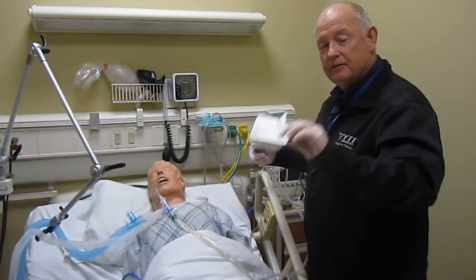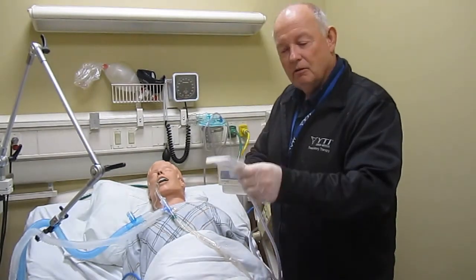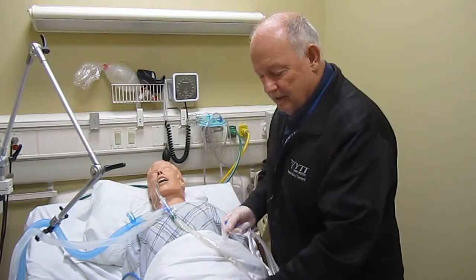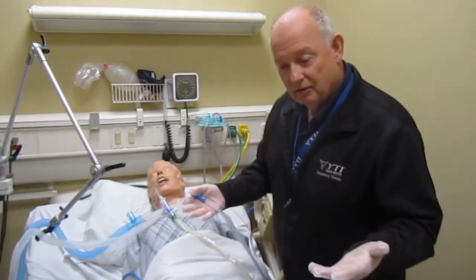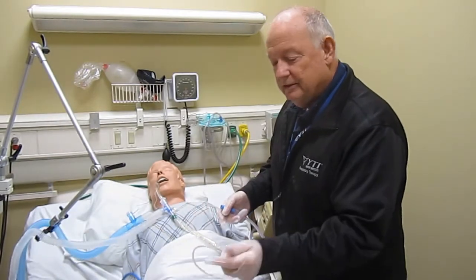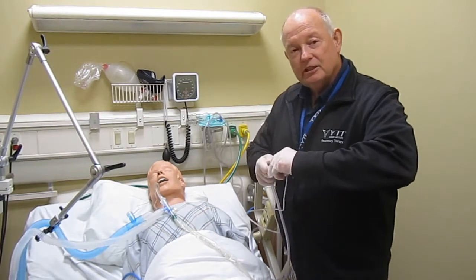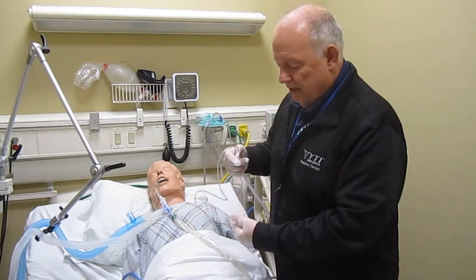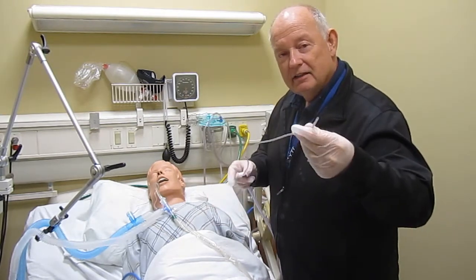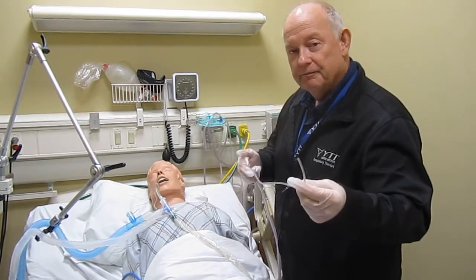The suction catheter. It's in the suction catheter tray. You open up the tray and it's nicely placed in there, sterile. You would then put on your sterile gloves. And using sterile technique, one hand connects it to the suction tubing, which is the dirty hand, and one hand, the clean hand, controls the tip of the suction catheter.